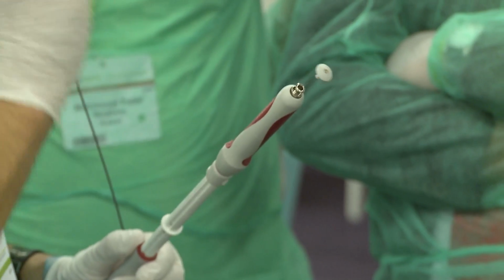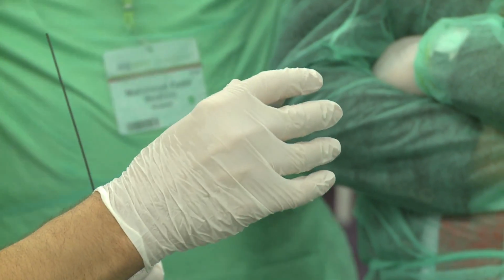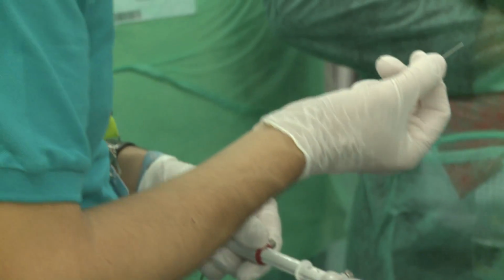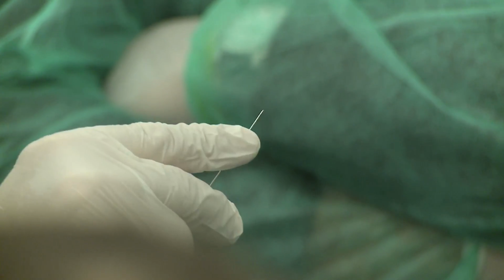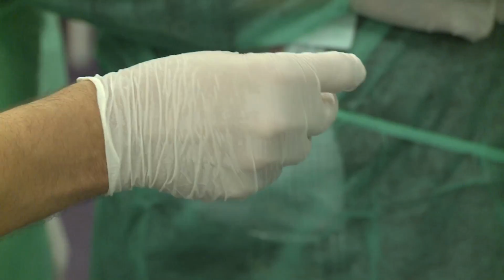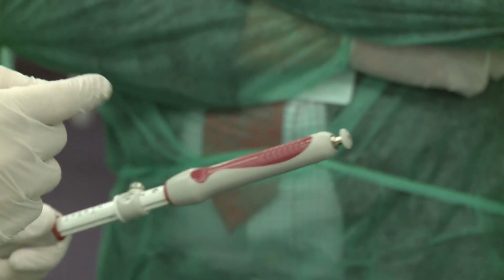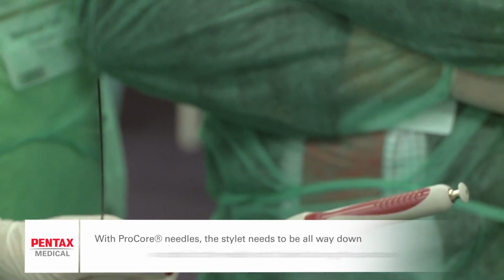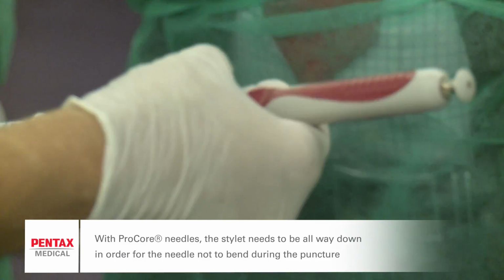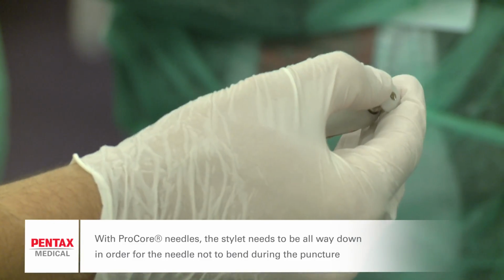Stylet. There are 2 differences for the stylet. For the Procore, you need to have the stylet all the way down. Why? Because in the Procore you have a side hole, which is quite small. The stylet is going to provide enough strength for the needle not to bend while you're doing the puncture. So when you're using Procore, you always need to place the stylet inside.